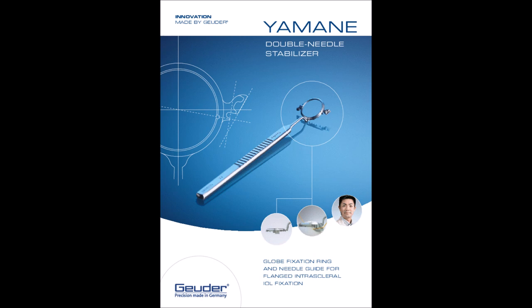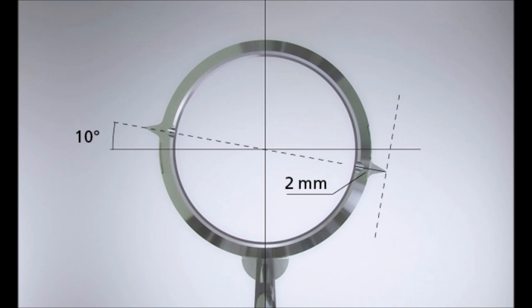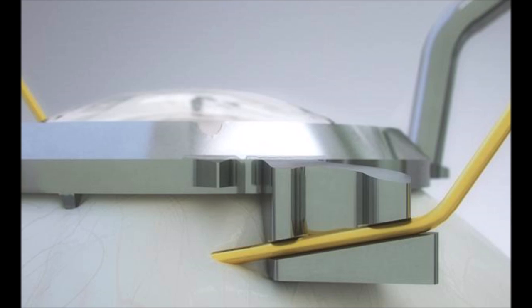It's supposed to bring more consistency, more reliability, more proper placement of the needles and the proper angles. As you can see here, there's a two millimeter demarcation line where you're supposed to pass the needle through the instrument. It has a needle guide right here that actually guides and tracks the needle into the sclera.